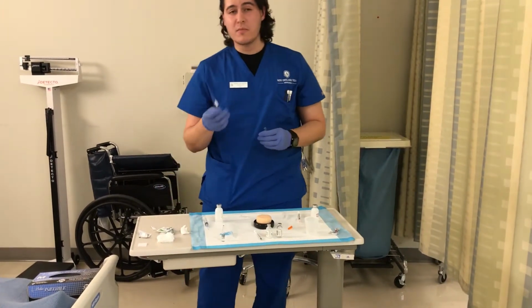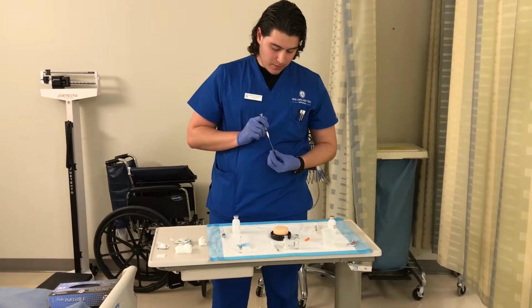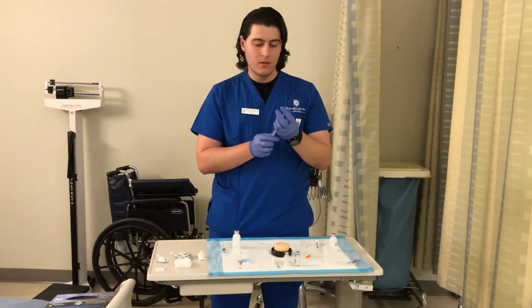So using the filter tip, this is important, especially because you don't want glass or anything in, so that's what the filter tip removes. Just going to put the filter tip in, turning it very carefully, not to break the pressure seal.